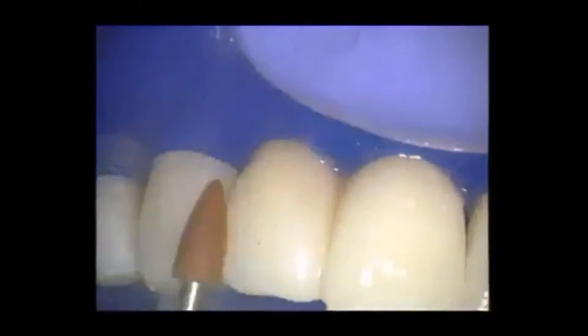One of the biggest problems with composite finishing is that we have too much heat generated. So I get these teeth very wet with the brownie, with the pumice, no matter what. You'll notice that if you don't use moisture, the composite will have a matte finish — because you're baking the composite. Once you've overheated it, it gets chalky, and the more you polish it, the chalkier it gets. So I use lots of water. The other thing is it'll also heat up the pulp, so there are a lot of reasons why we don't want to overheat the teeth.